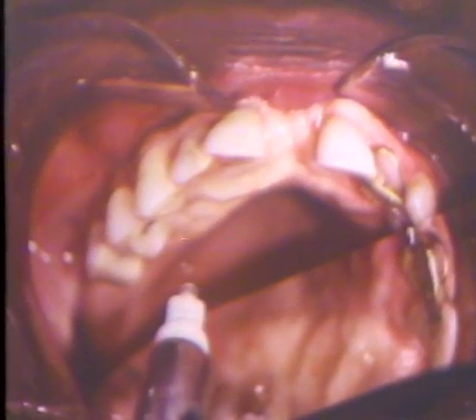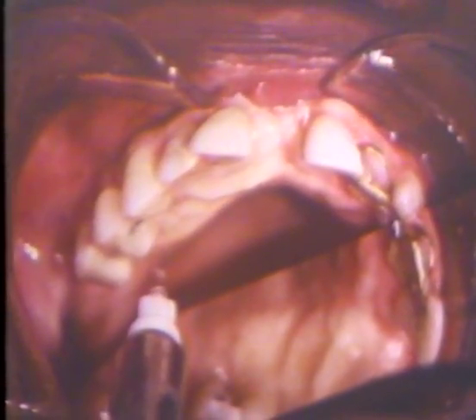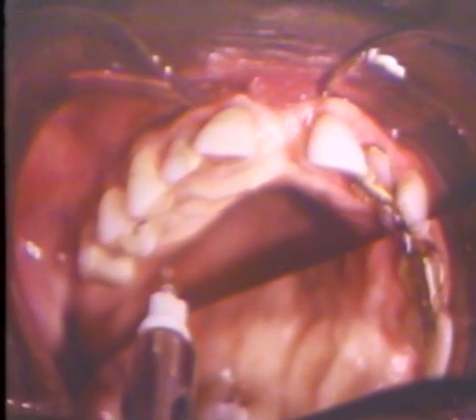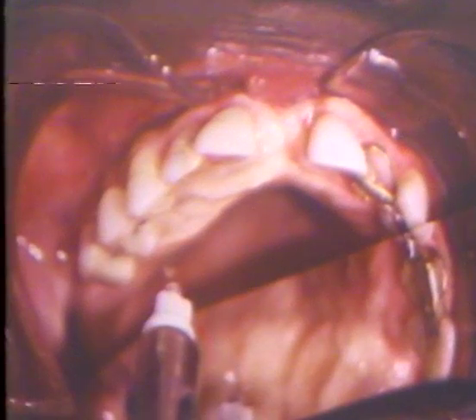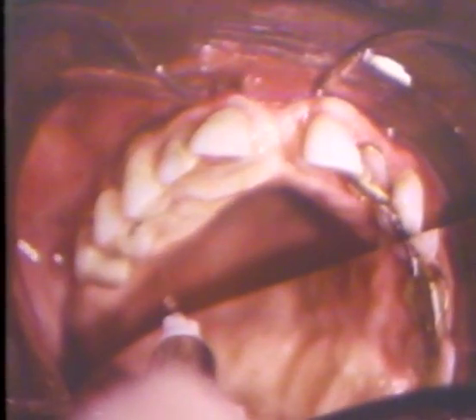The deepest defect is between the first and second premolar. On the palatal aspect, there is a deep pocket extending into the osseous tissue. This actually is a bony defect, which is sometimes classified as an infrabony pocket with one osseous wall.